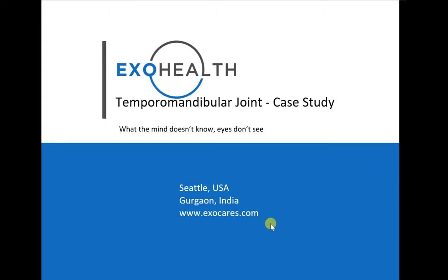Hi, so here I am presenting a case of TMJ study. So let's look at this case.